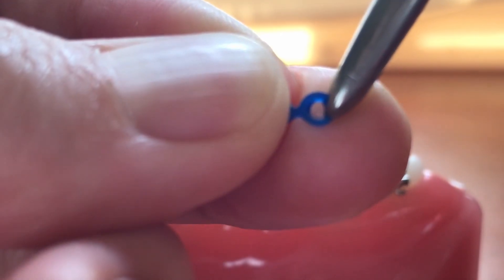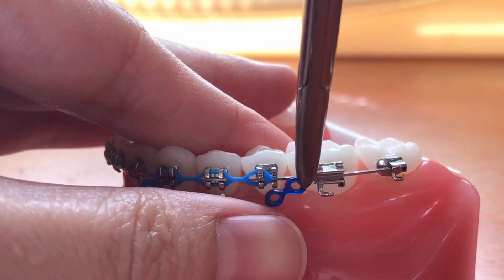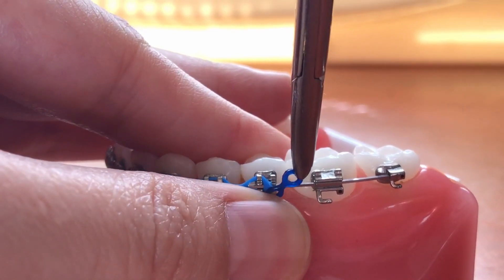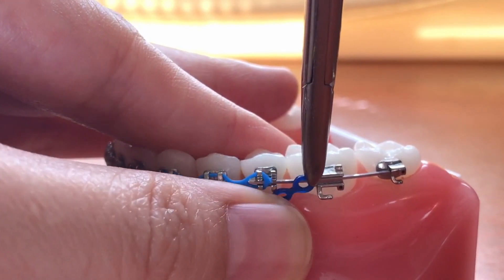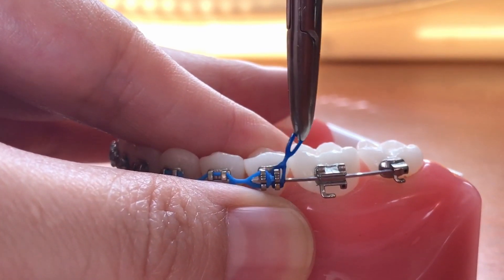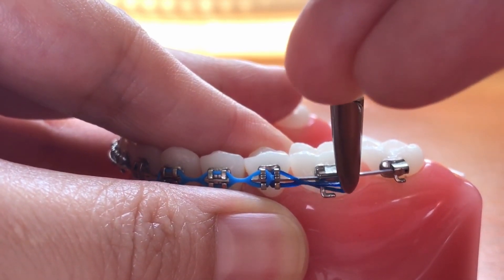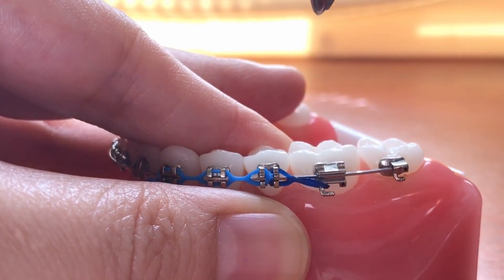Now grab the two-unit power chain that we would be mailing you, and go ahead and engage the back half of the bracket just like this. Hook from the bottom and then to the top, and then stretch it backwards to get it onto the hook on the back tooth.